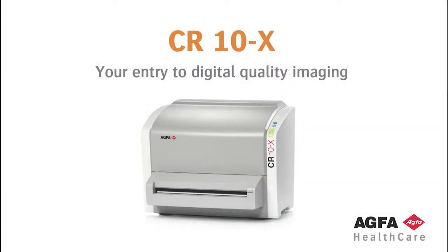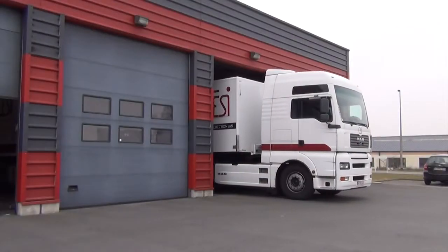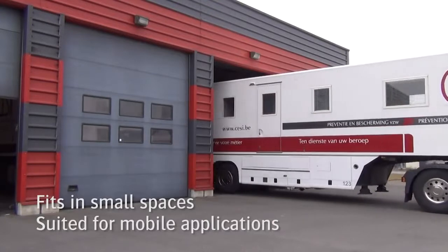CR-10X, your entry to digital quality imaging — a mobile and affordable digital solution. The CR-10X digitizer is compact and robust, and ideal for mobile and space-restricted radiology environments.